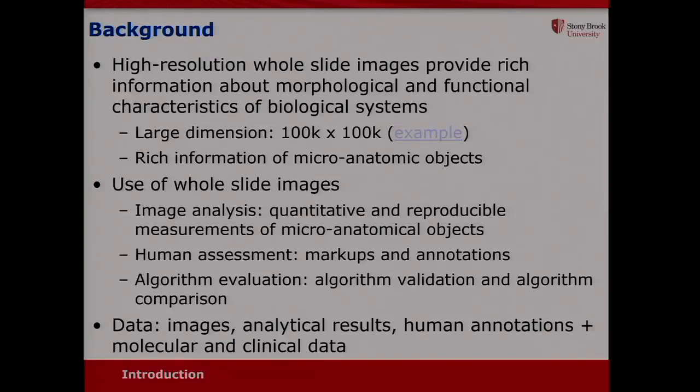As I mentioned the last time in the seminar, pathology images are a new flavor of medical images. Traditionally, pathologists use a microscope to view a tissue to make the final diagnosis, to see if there's a certain disease or not. In general, if you want a final diagnosis, you have to use a biopsy or tissues. Basically, the pathology lab will make the decisions using a microscope. So pathologists have to use a microscope to read a lot of information from the tissues.